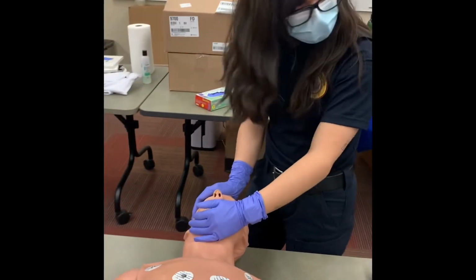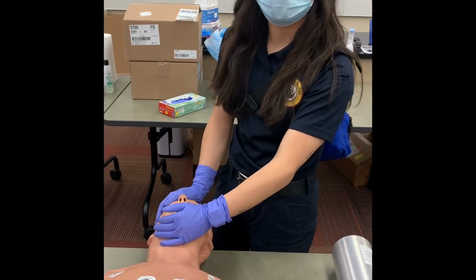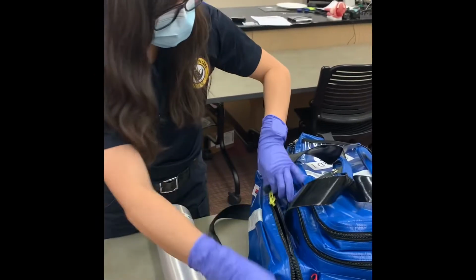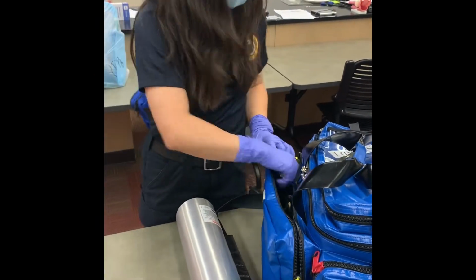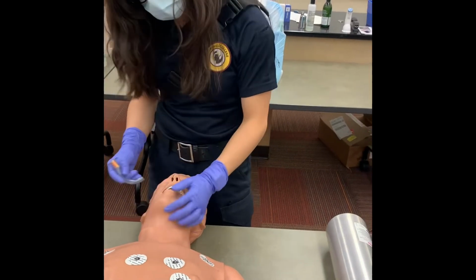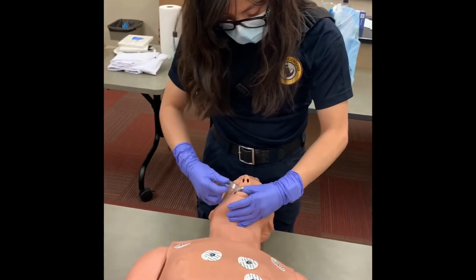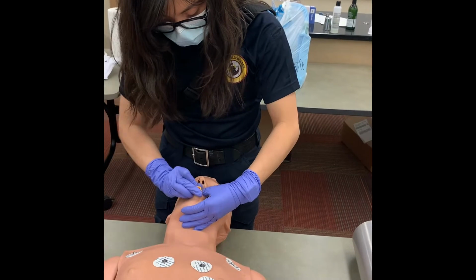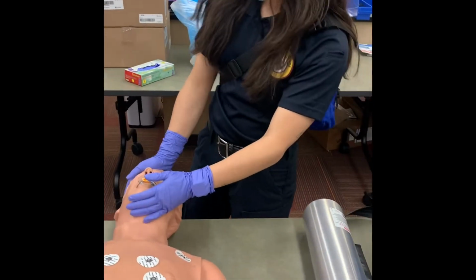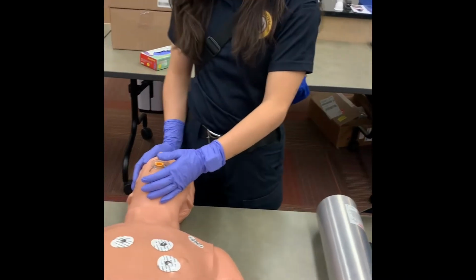Okay, awesome. So I'm going to go ahead and insert an OPA, an oropharyngeal airway adjunct. And I'm going to measure this from the tip of the earlobe to the corner of the mouth. So this is the appropriate size. I'm going to go in at a corner, 90-degree flip, and that should maintain the airway open. No gag reflex is present, and the patient accepts the adjunct.